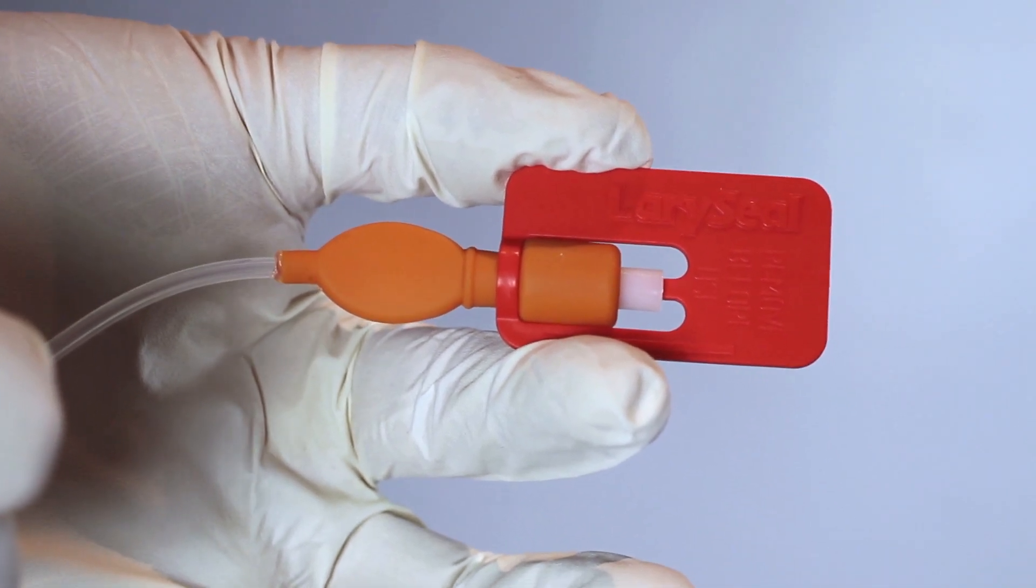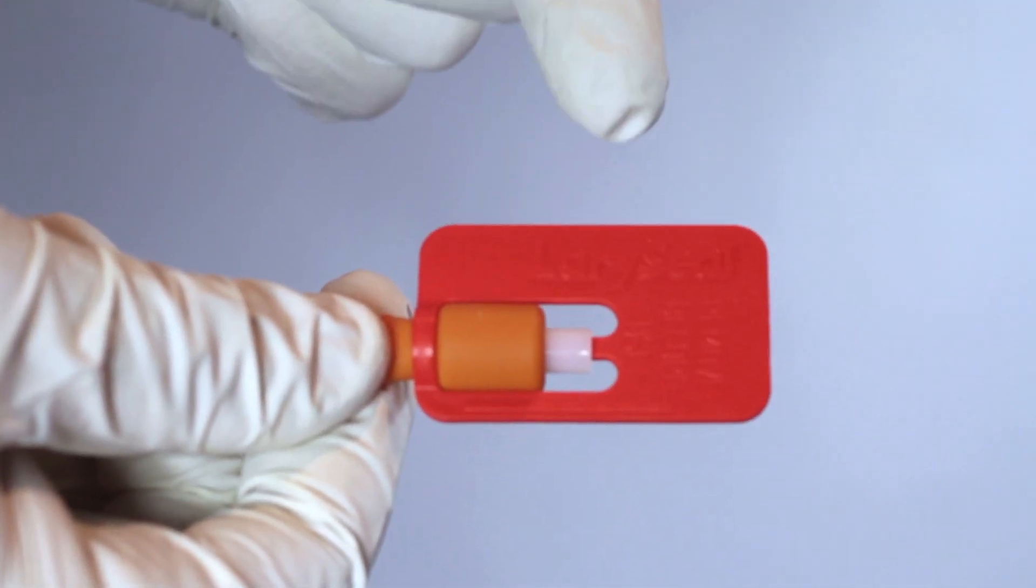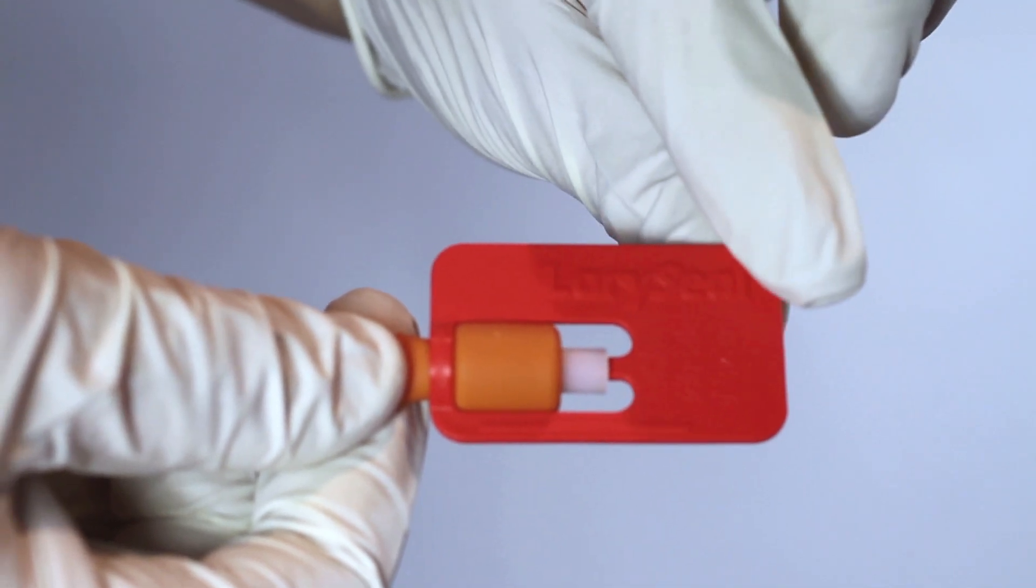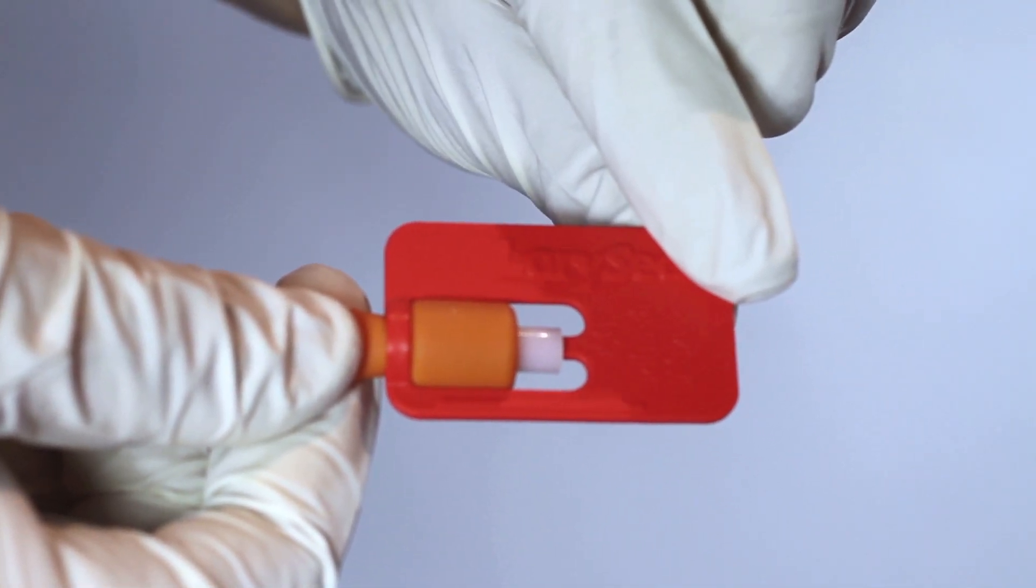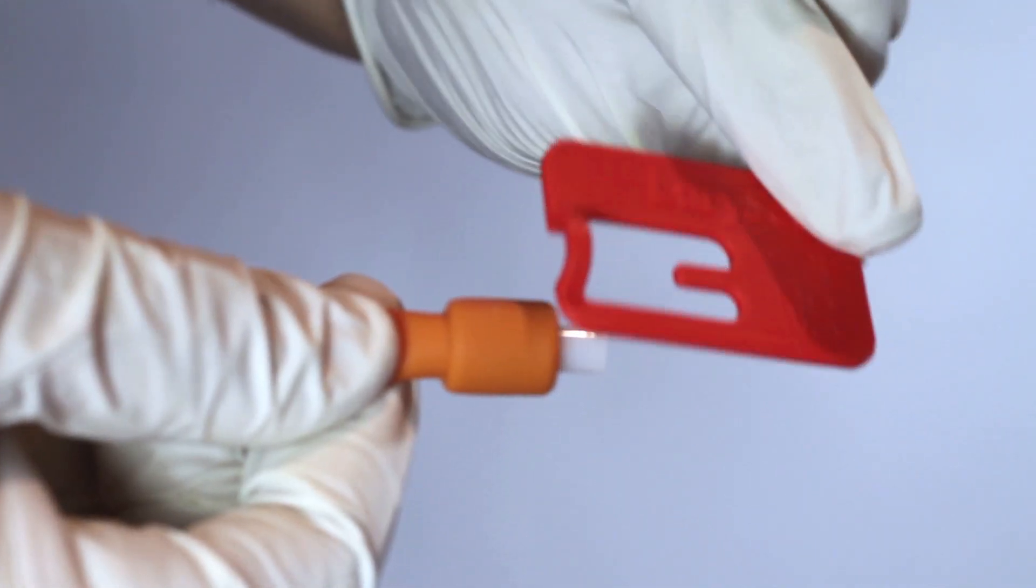Immediately before use you will need to remove the valve decompression tab by holding the balloon between your thumb and index finger before using a twist and pull action to remove the tab safely. The tab can now be discarded.